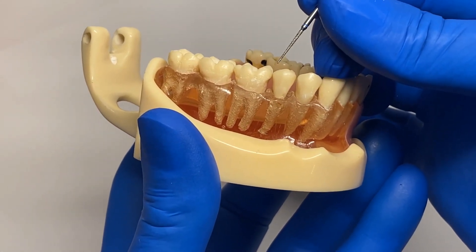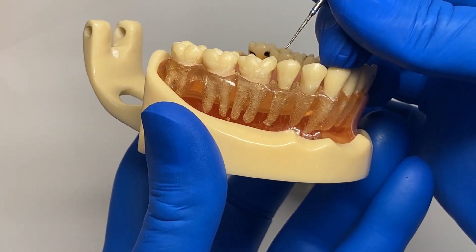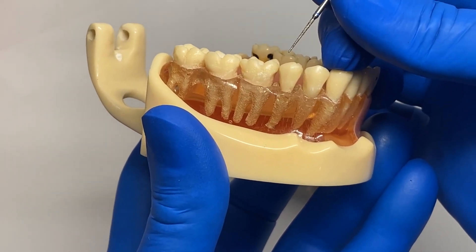Using our product, the flame, you can create a notch or purchase point in any tooth or retained root to gain more leverage with your elevators.